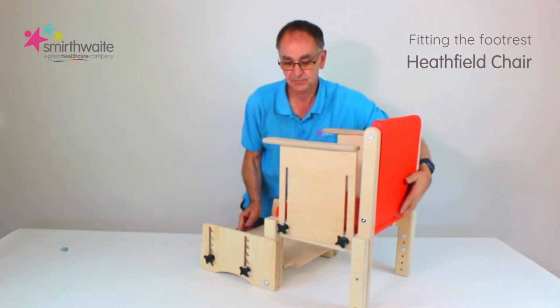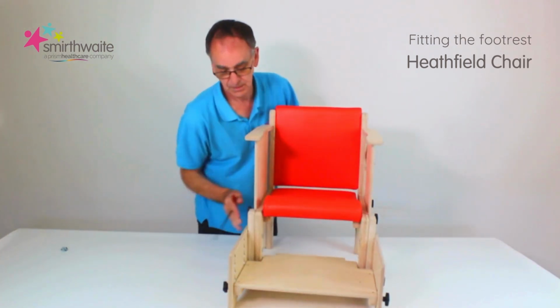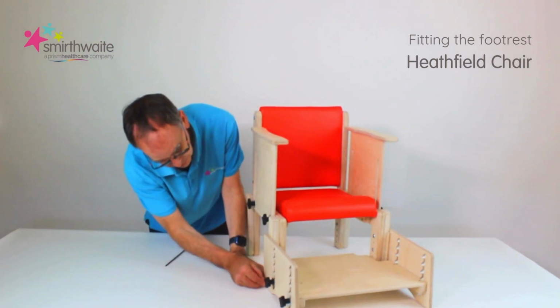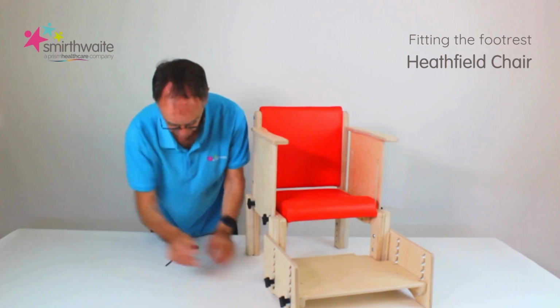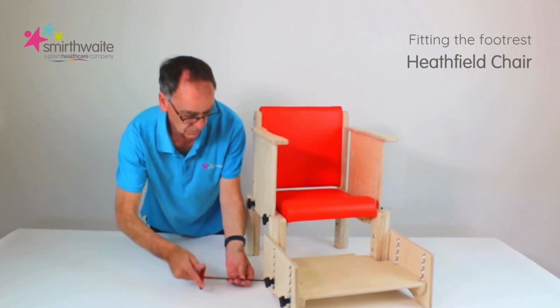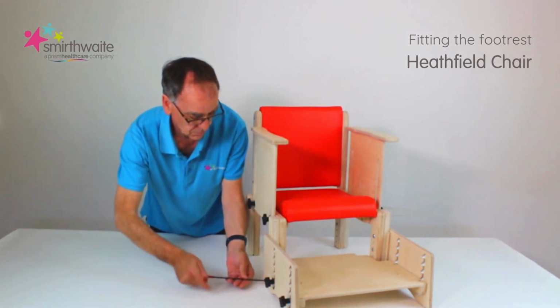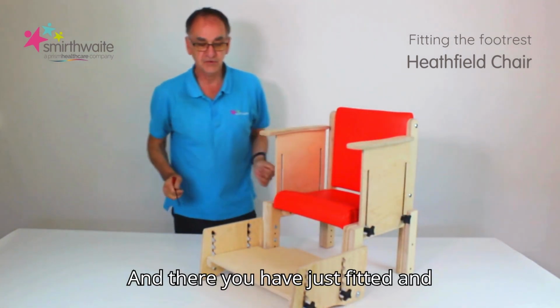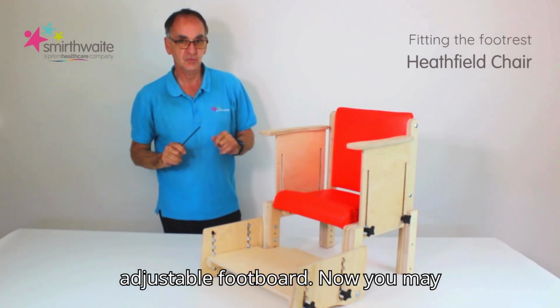And the same on the other side. And there you have just fitted an adjustable footboard.